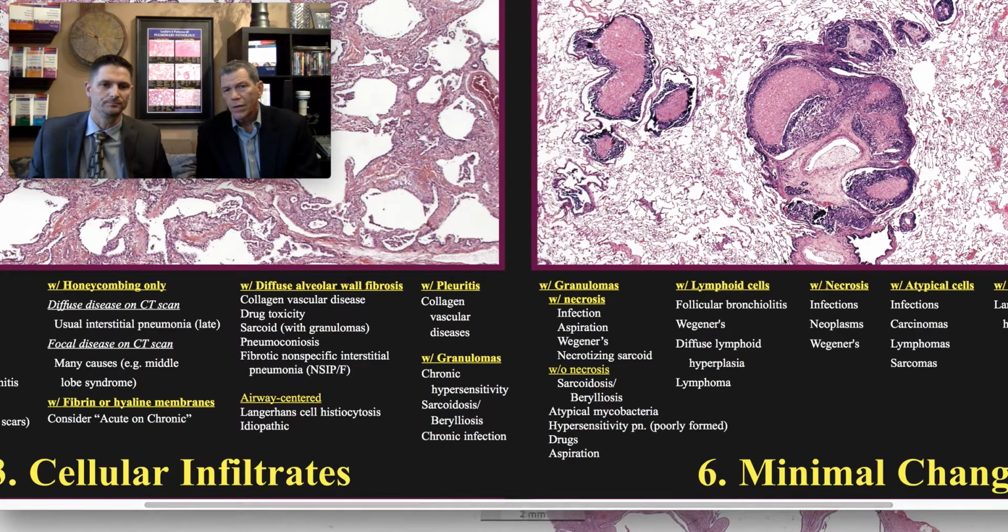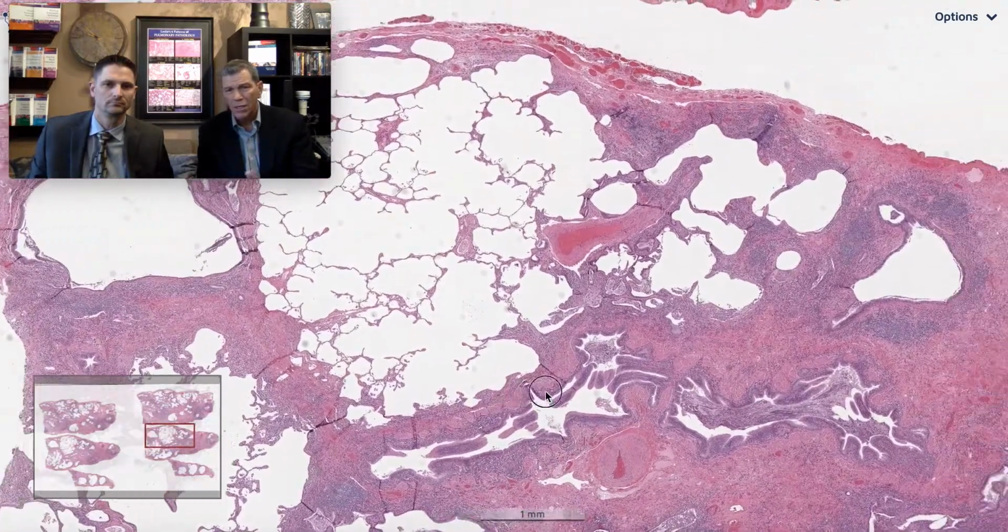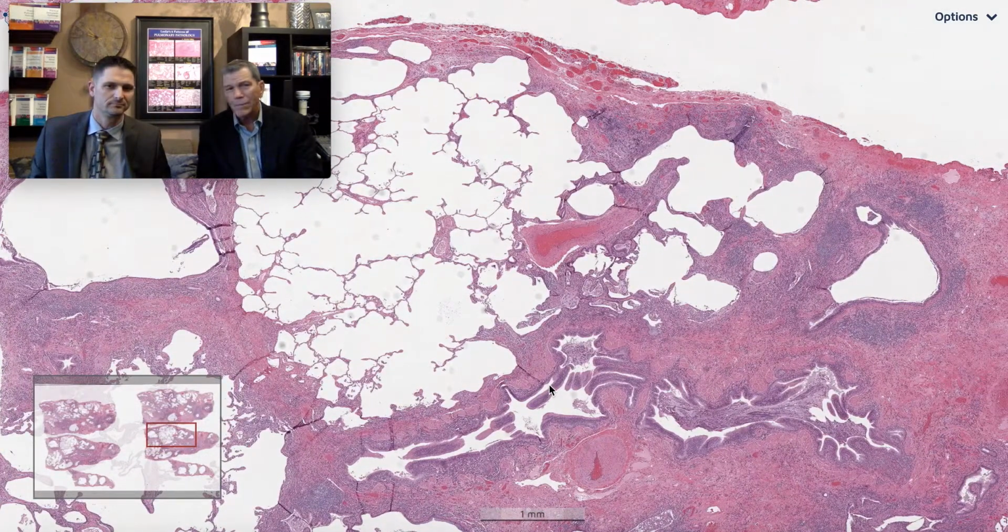We have to look at our case and figure out, do we think this fibrosis, this pink consolidation, is uniform throughout the biopsy, or are there areas where the alveolar parenchyma looks normal? Well, just from this image, I think it's pretty clear that this is a highly variable process. We have areas that are completely spared, and we have areas like this that would probably meet most people's criteria for microscopic honeycomb remodeling. Right. Advanced fibrosis, architectural distortion, cystically dilated spaces filled with mucin debris, and I would hazard to guess that those are lined by ciliated respiratory epithelium there. Yeah, that's an interesting point.